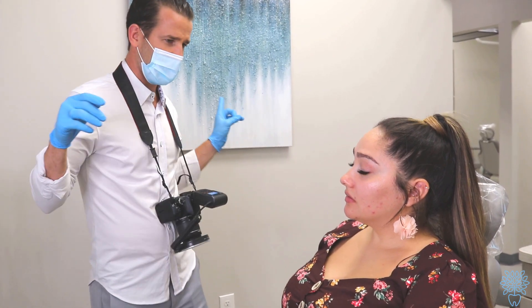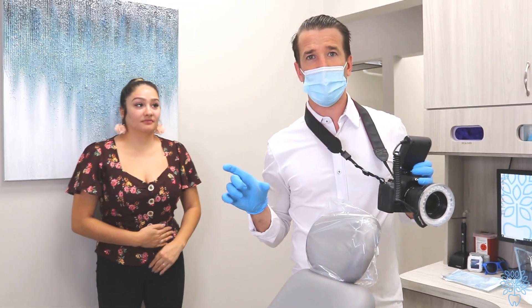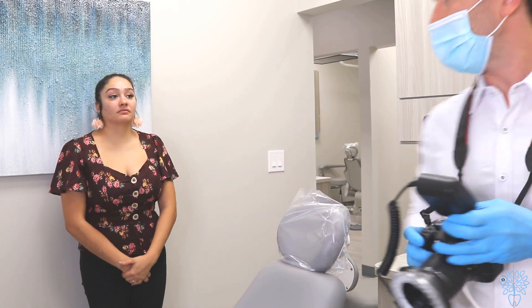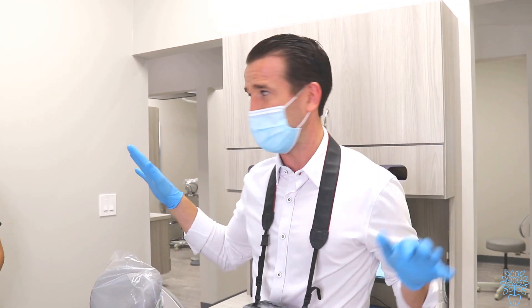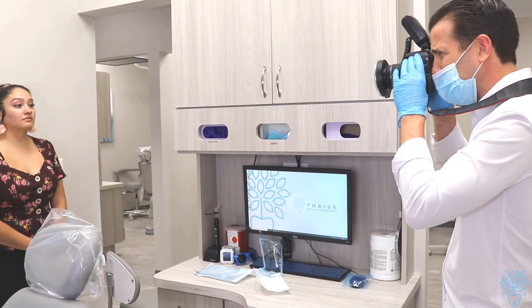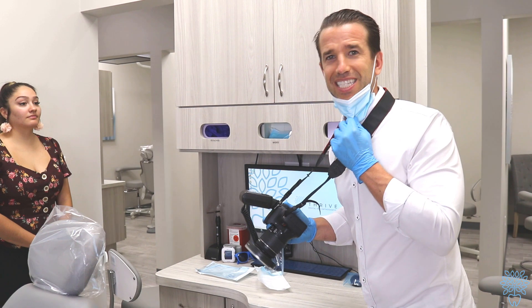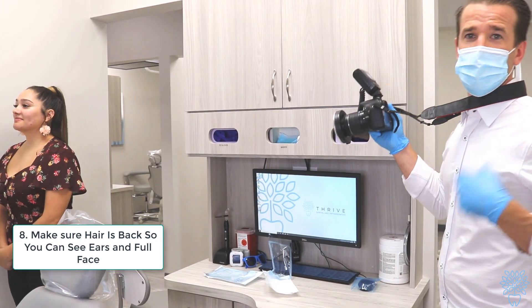Now we have three last pictures which are super easy. Switch to the automatic function — the green or A function — for all the facial pictures. We want a very plain background, so if there's something in the back, have the patient take a couple steps to the side. Take one picture standing nice and relaxed, one smiling big showing teeth, and one profile to the side relaxed.